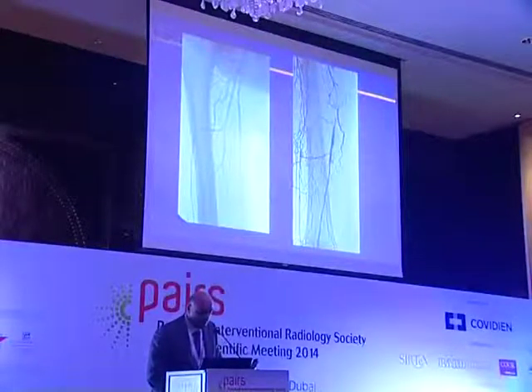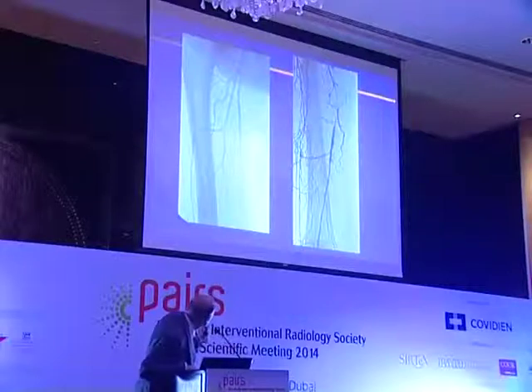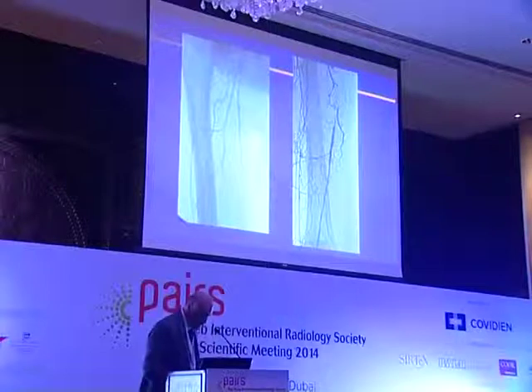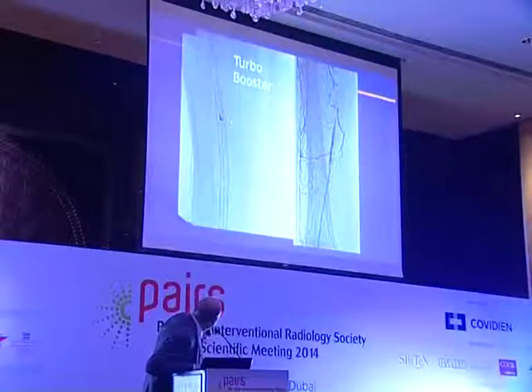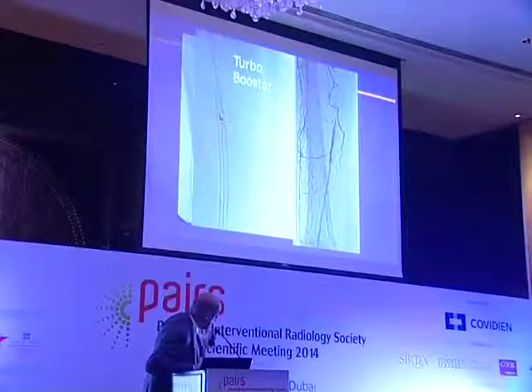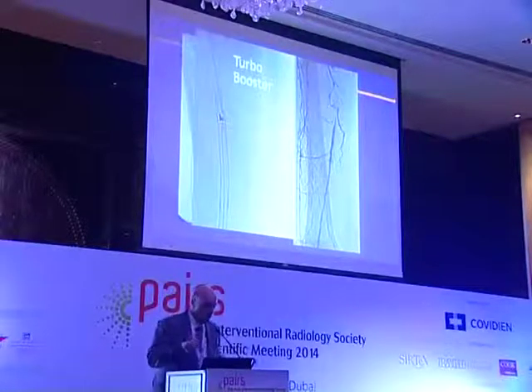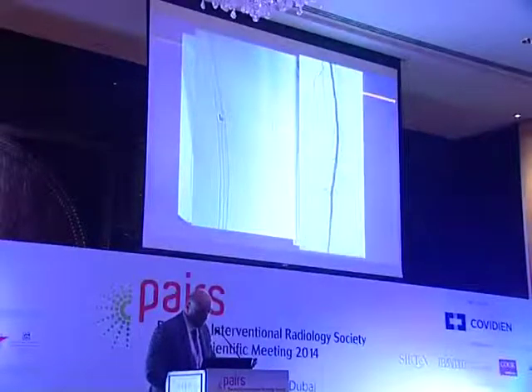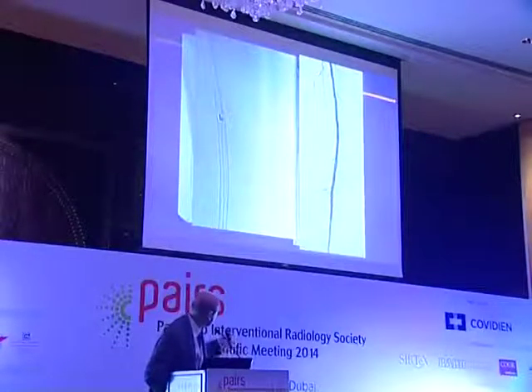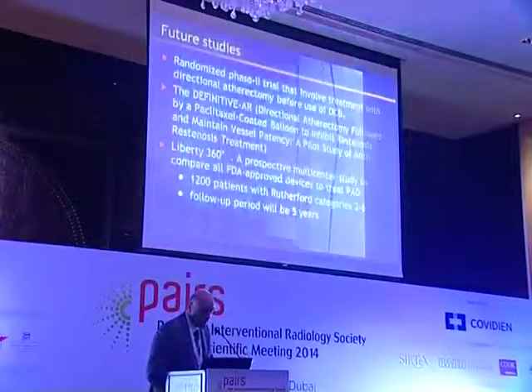This is a case of in-stent stenosis, and you see here a complete occlusion and the reconstitution distally. And this is the Turbo Booster, and this is the active tip here, and it sits on a ramp that you push. You do the laser, and you try to do 4 different quadrants to get better luminal gain, and then you angioplasty, and you get better patency.